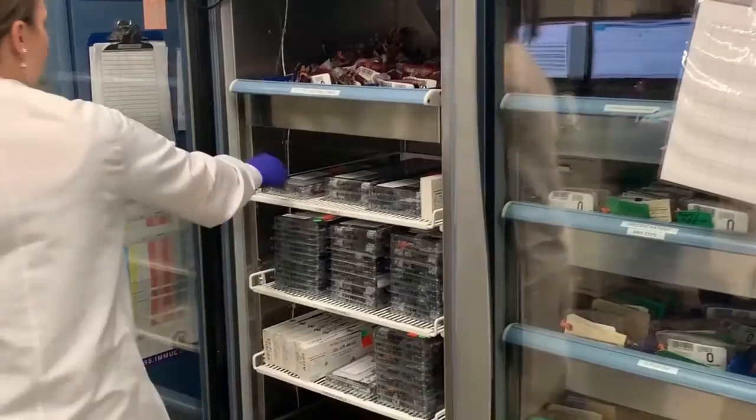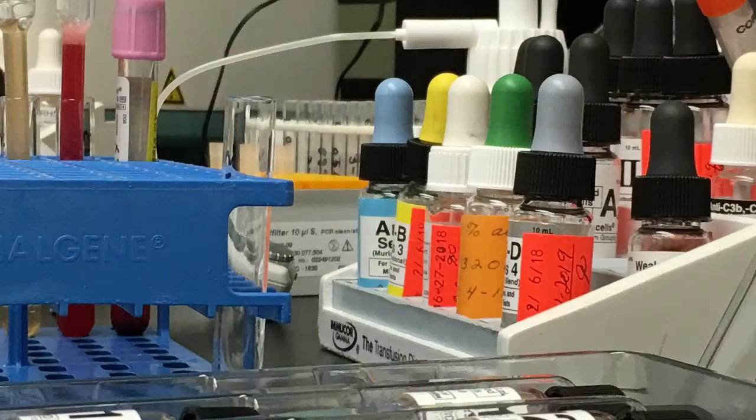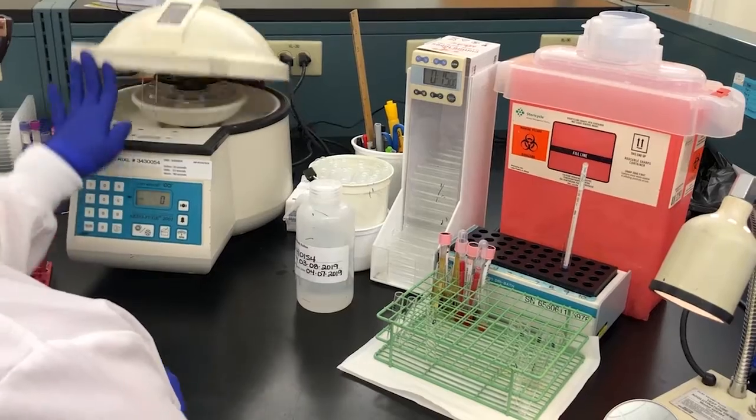Our reference lab is very patient focused. Before somebody receives a blood transfusion at one of our hospitals, they do testing before to determine the patient's blood type and if there's any red cell antibodies present. And if there are, some of the hospitals are capable of resolving their own problems, and some aren't. And so the ones that aren't, or the more difficult cases, get sent to our reference labs.